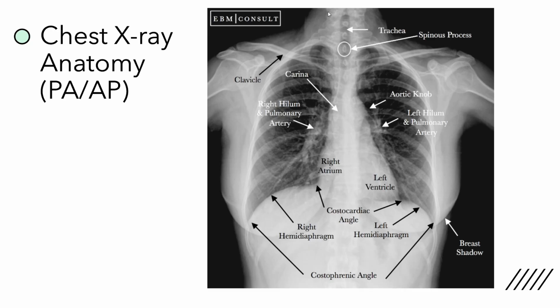We see a lot of the cervical spine in the neck. So this right here is T1. This is the start of the thoracic spine. We know that because what you'll learn when you start to learn anatomy in the spine is that there are little projections off to the sides called transverse processes. In the cervical spine, they point downward, and in the thoracic spine, they point upward. So that first one that's pointing upward there is T1. And we could, if we wanted to, count all the way down to T12. It's just a nice way of knowing exactly where you are in the spine.